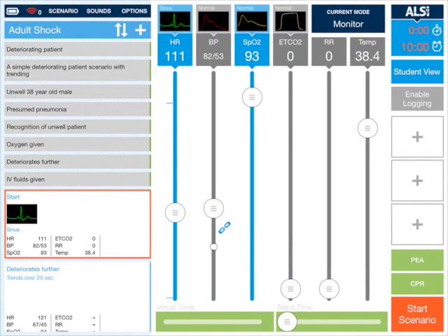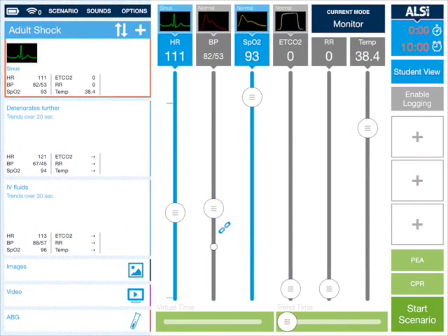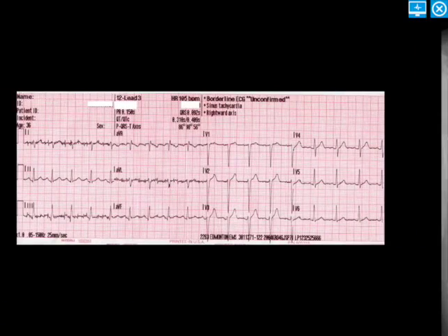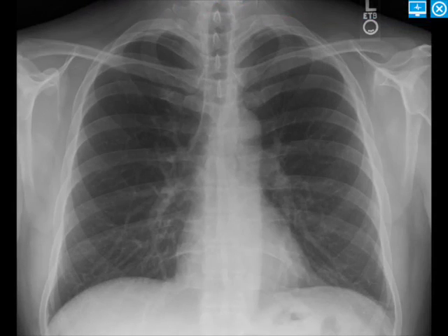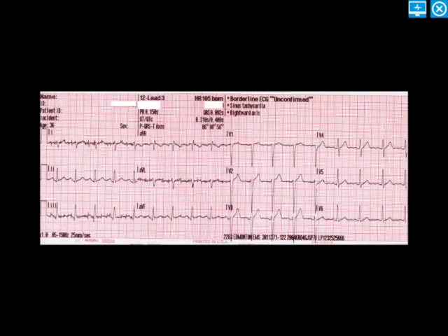We go into the scenario and scroll down the side, and you can see the images, video, and ABG have been added. We'll tap on images — up it comes as a preview. We can swipe to the side to show the chest x-ray and back again. That little icon in the top of the monitor with an ECG in it — as soon as you tap that, it will send it over to the student screen.